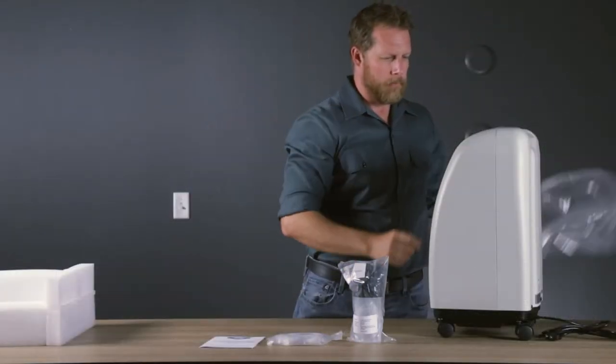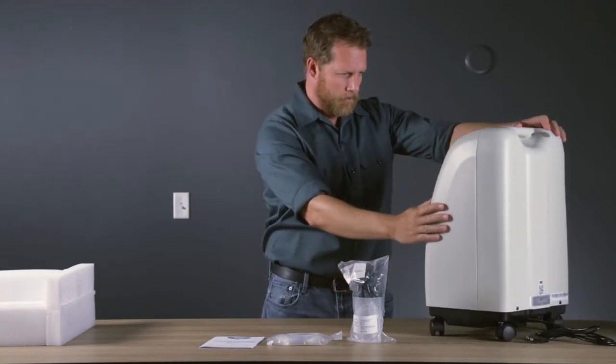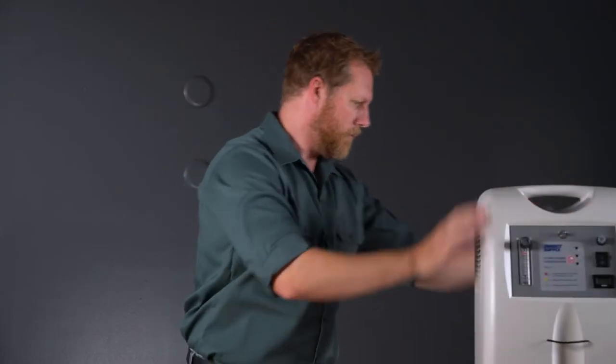Examine the exterior of the Oxygen Concentrator for nicks, dents, scratches or other damage. After inspection, plug the concentrator into a 120-volt grounded AC power source.